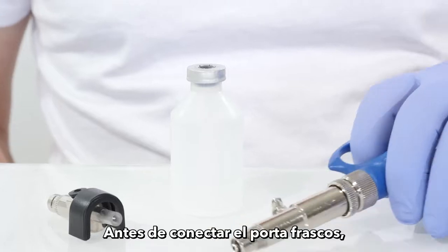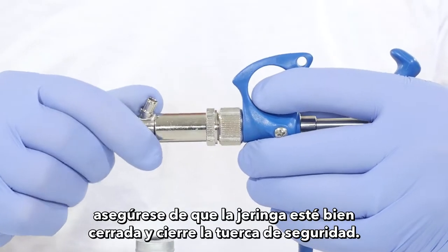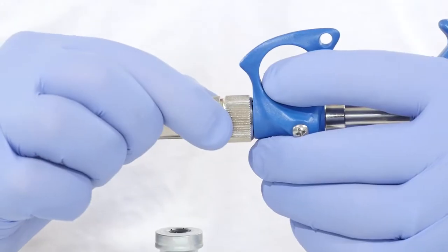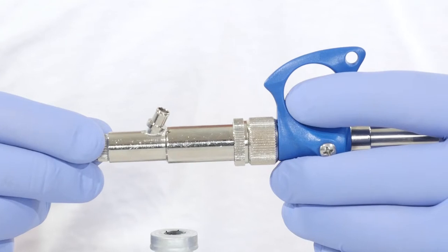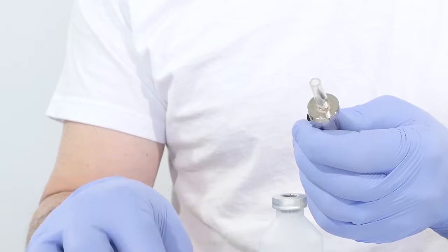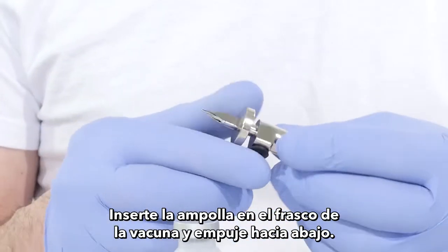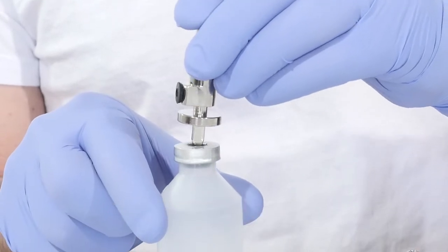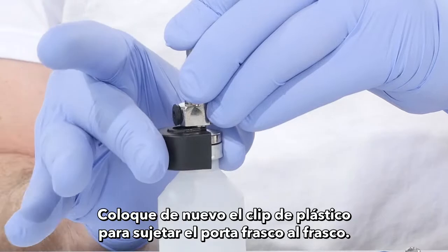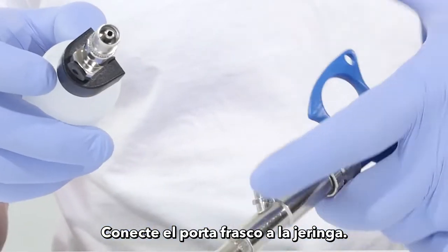Using the vial holder: before connecting the vial holder, make sure the syringe is properly closed and lock the safety nut. Remove the black plastic clip and safety cover. Insert the vial into the vaccine bottle and push it down. Return the plastic clip to hold the vial holder to the bottle, then connect the vial holder to the syringe.